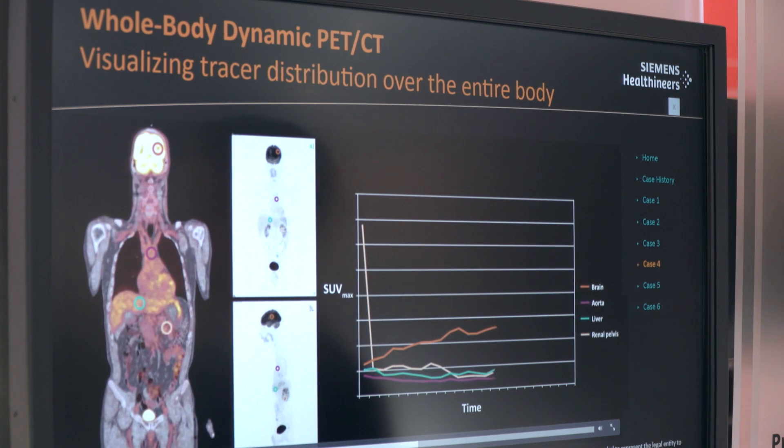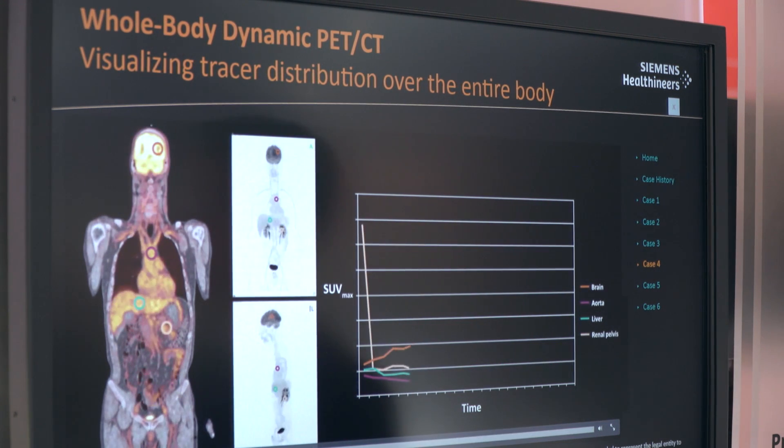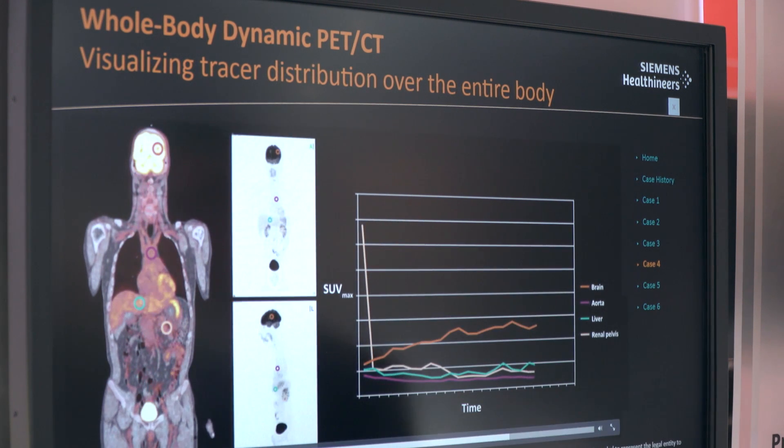With whole body dynamic imaging, we can visualize dynamic images of the entire patient body, as you can see over here.